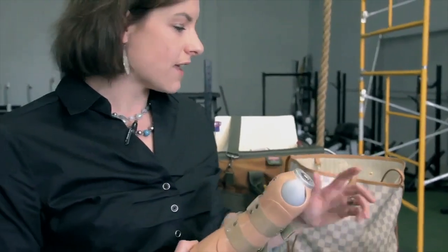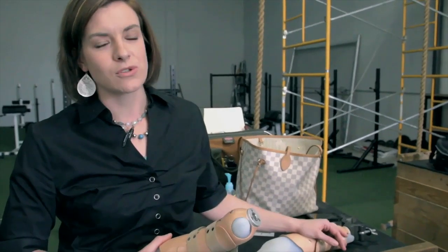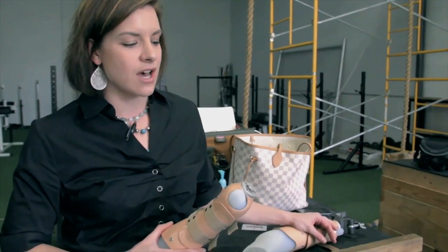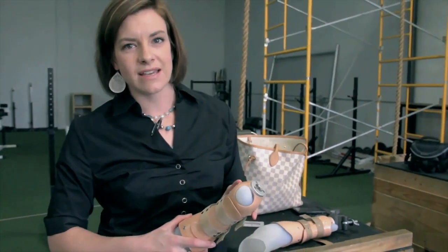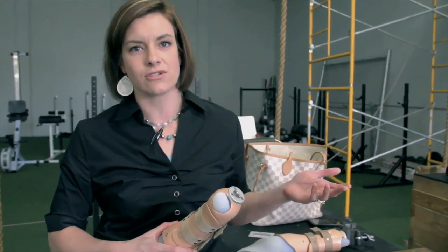Today we're back at Practice CrossFit with Angela Carr doing a final fitting on her prosthesis. We made some changes including coming up with our final length, which is shorter than the initial prosthesis that we had made. We have Bob here today with Bulldog Tools, who is going to be coming up with some designs for the addition of a dynamic wrist unit and a shorter terminal device. We have improvement in the socket design and suspension, with further design in the future regarding additional components.